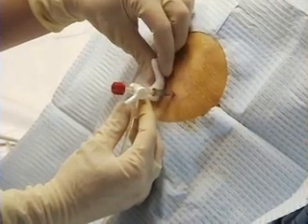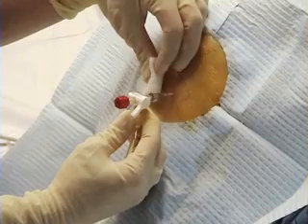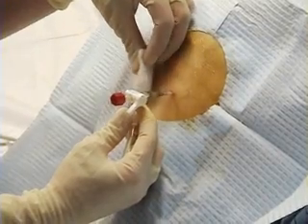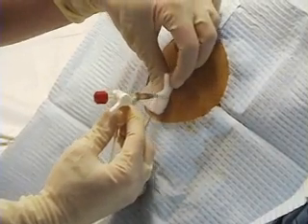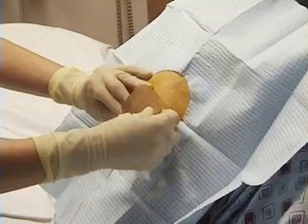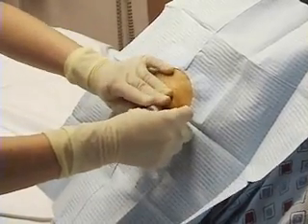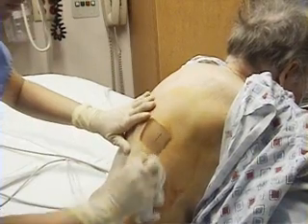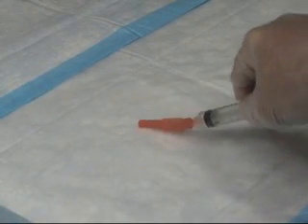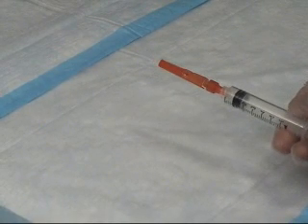On completion of fluid collection, rapidly remove the catheter as the patient holds his or her breath at end expiration. Cover the needle insertion site with an occlusive dressing and clean the surrounding skin. At the end of the procedure, make sure that all needles are placed into appropriate safety devices.